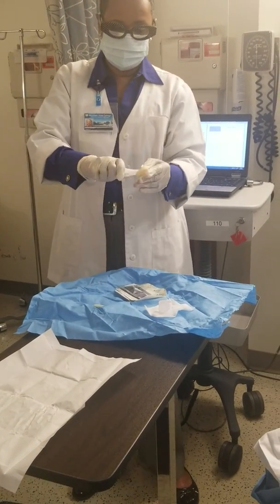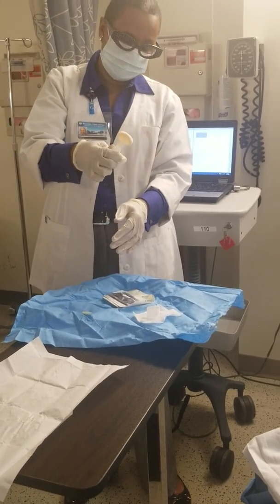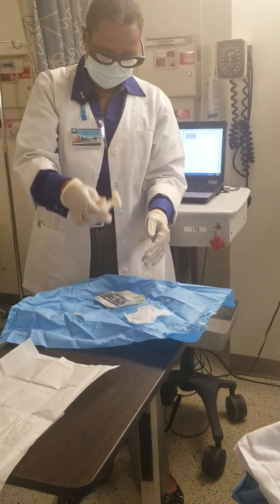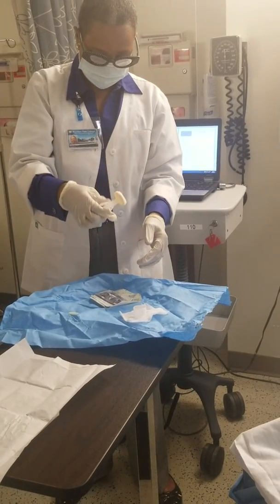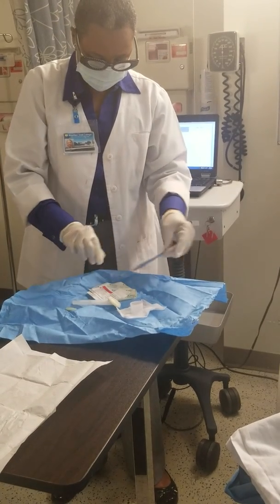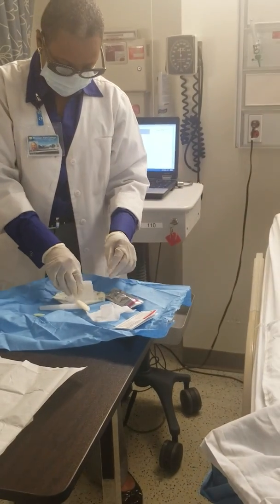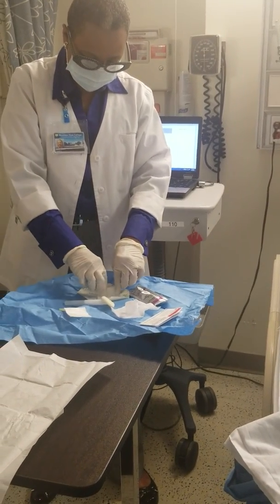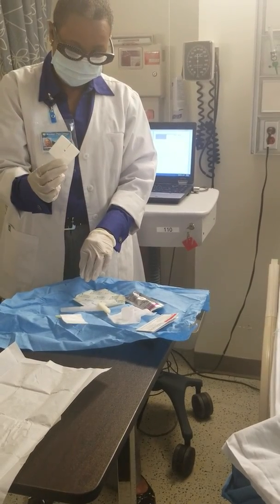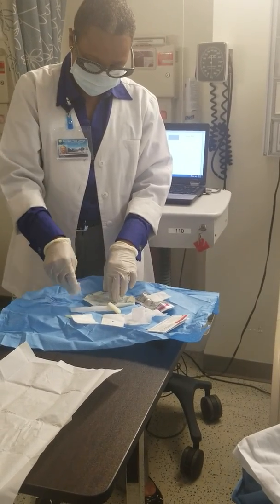This is your chlorhexidine. To activate this, you have to squeeze it and squeeze it down, and then it'll come to the surface. That's the biggest thing. You got to hear it pop. The alcohol swab you may or may not use. Sometimes they're not using as much alcohol. They don't use this anymore, because we have a biopatch now, but they used to. Little piece of gauze, and finally that.